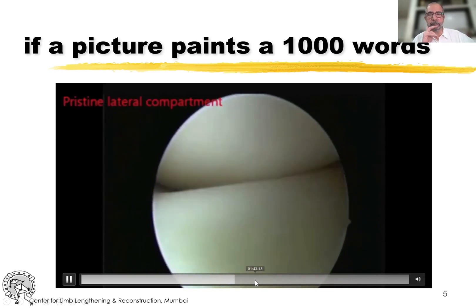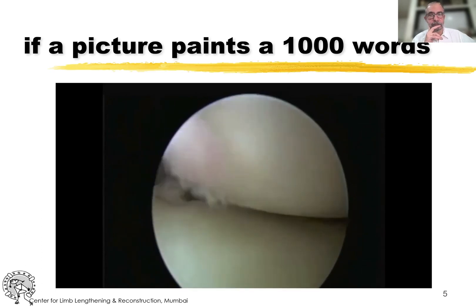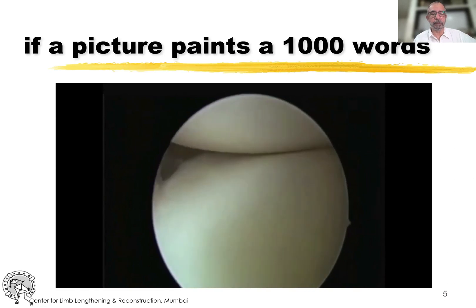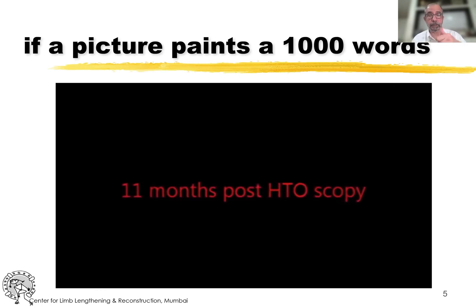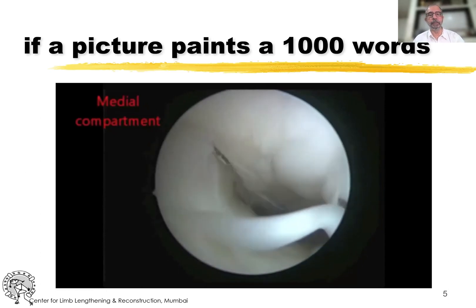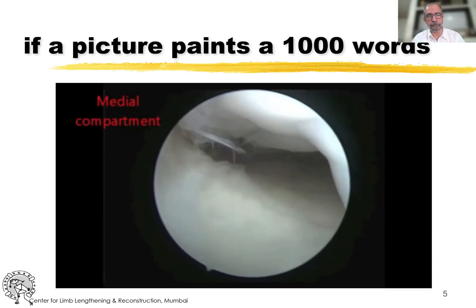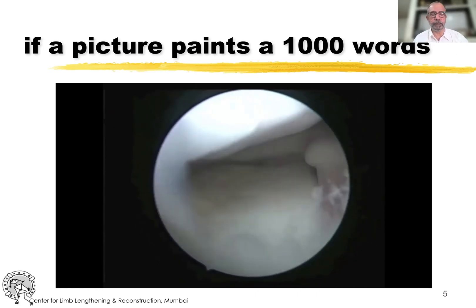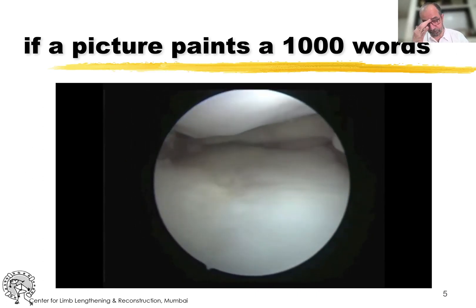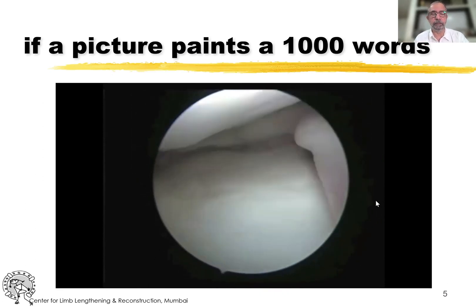The lateral compartment, as is usually the case, was pristine. Eleven months later, once this osteotomy had healed, he went and did a second arthroscopy because the patient had come in for an osteotomy on the other side. Look at this medial cartilage now — that entire bare area, without doing any cartilage regenerative procedures, just unloading the medial side, this has healed.